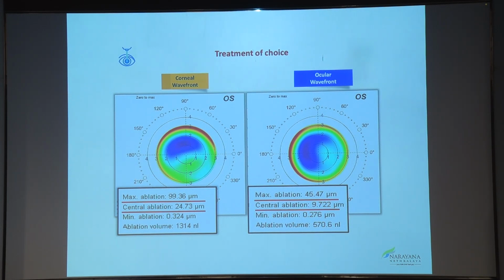But when you bring in a lens to support itself, the ablation suddenly drops to 9 microns. That means the machine was burning close to around 15 to 16 microns unnecessarily, a burden on the cornea. So this is a very important factor in understanding the laser correction. When you have very thin corneas, how do you balance it?